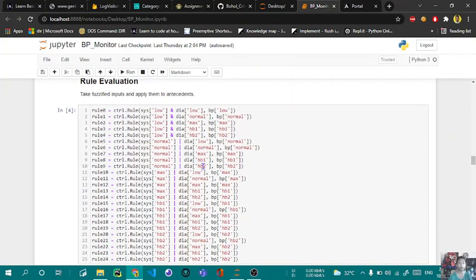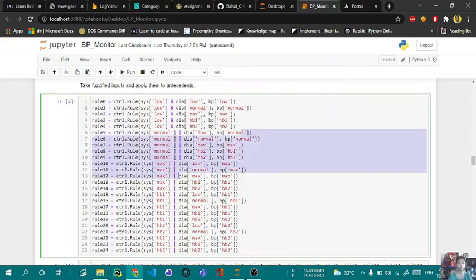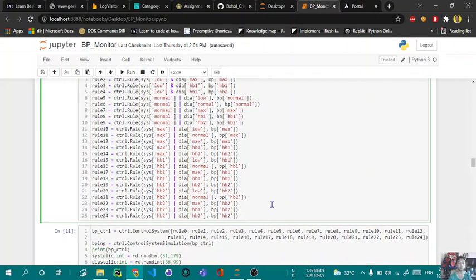Here in rule evaluation, we take the fuzzified input and apply it to the antecedents. If we have low systolic and low diastolic, we have low. If systolic is low and diastolic is normal, we have normal. Just like what I've said earlier, if you have different categories, the higher category would be the reading of it, just like low and normal, so normal would be the category. Normal systolic and low diastolic, so normal would be the reading of it. And so on, until high blood 2.